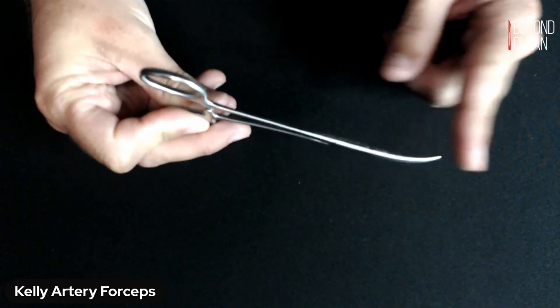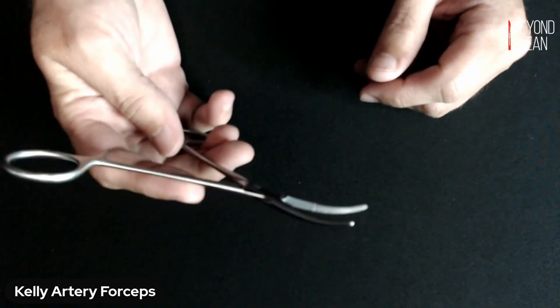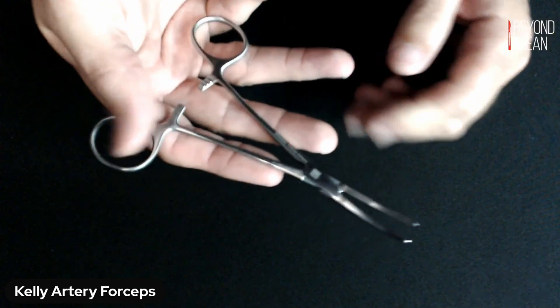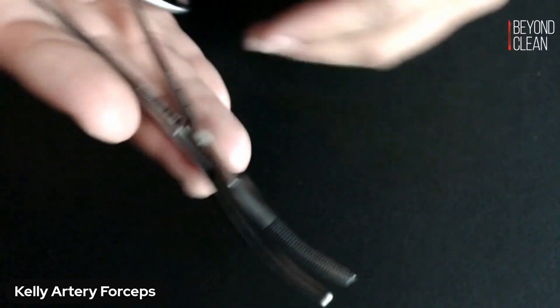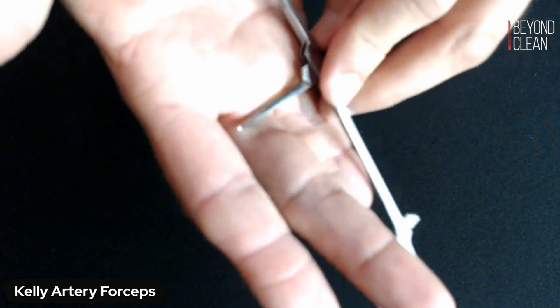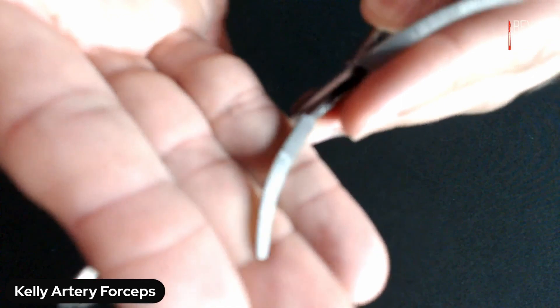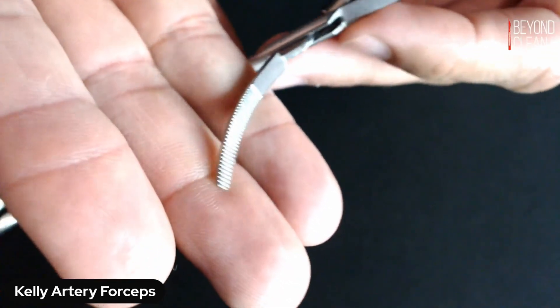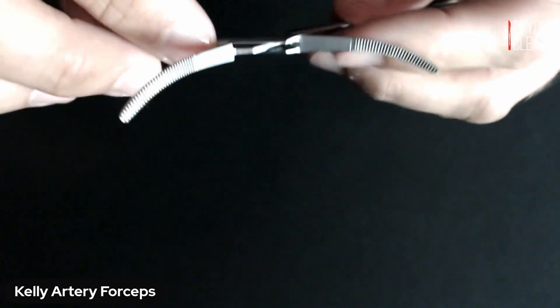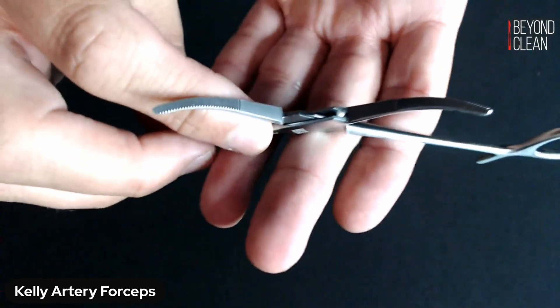You can see that curve there on the distal tip. You can see it even more prominently when you open up that jaw. So in inspecting your Kelly's, just like with all of your other clamps, you're going to want to take a special look into those grooves and those serrations on the jaw. That's where a lot of your bio burden and debris is going to be hanging out right there on those jaws.